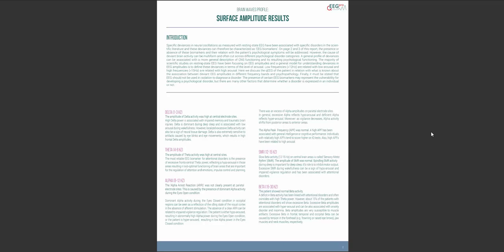For alpha, you'll get a little bit more information since it takes both the alpha activity during eyes open and eyes closed conditions into account. The so-called alpha arrest reaction reflects the difference in alpha between the eyes open and the eyes closed conditions and is indicative of the arousal vigilance level of the patient. The alpha peak frequency is a feature of alpha activity that is independent of alpha amplitudes and is described separately.